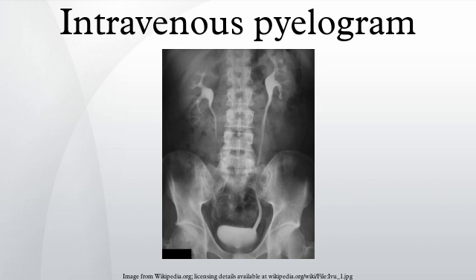Immediately after the contrast is administered, it appears on an X-ray as a renal blush — this is the contrast being filtered through the cortex. At an interval of 3 minutes, the renal blush is still evident but the calyces and renal pelvis are now visible.